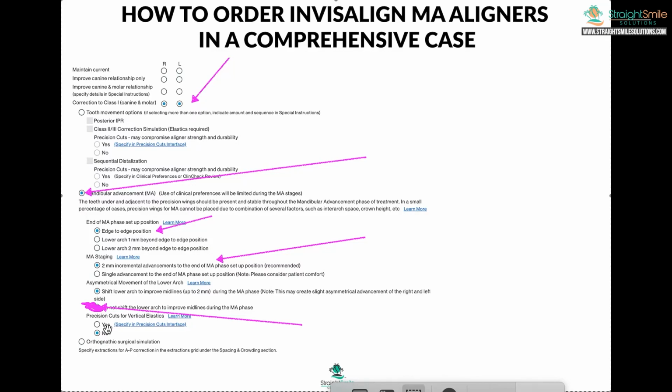Cases aren't always accepted. And if it's not accepted, you can always come up with a different plan. Anyways, that's pretty much the basic overview on MA for Invisalign. All right. Thanks so much.